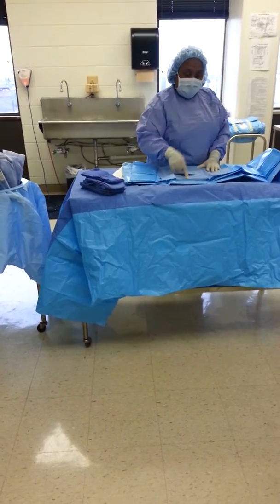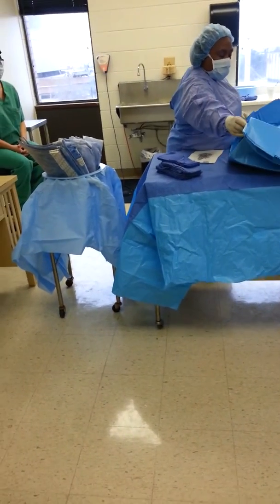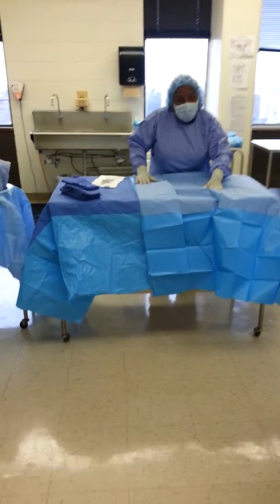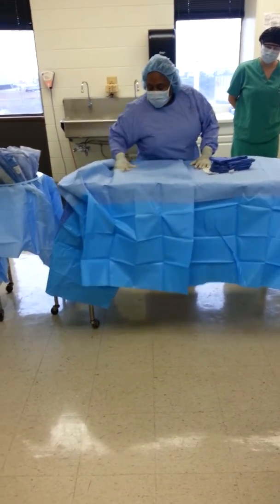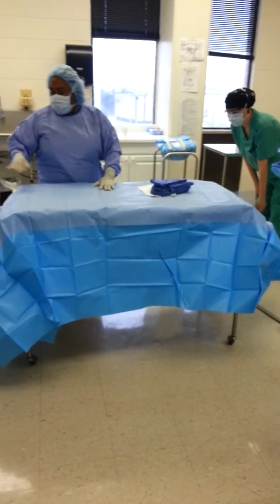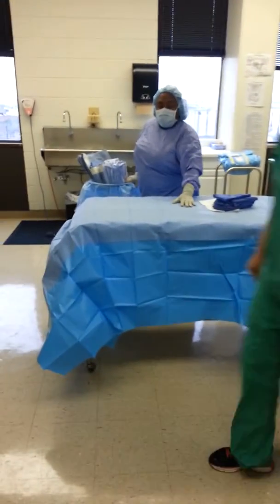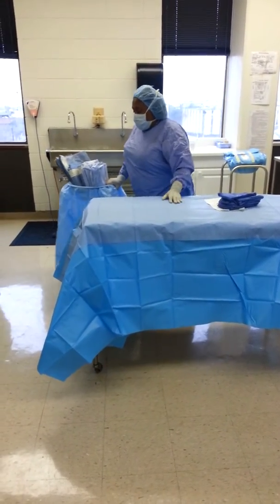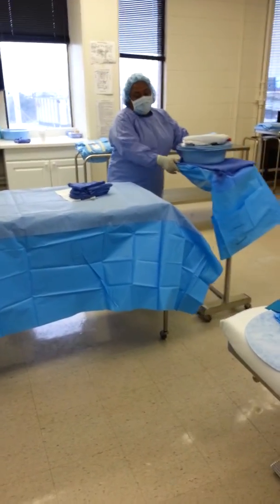you see how if I open it this way, the double reinforced is front to back? I want it to be lengthways. So now what I'm gonna have to do is position this to fall this way. You see I'm holding it with my right, smoothing out with my left. And my hand staying at the tabletop. So now I've reinforced it double. My circulator can walk around my table, to pull on it, but you make sure you're holding it with your hand and secure it so it doesn't shift. And notice when you move your ring stand, it's only table level. Okay, so now I can close this, and I can close this.